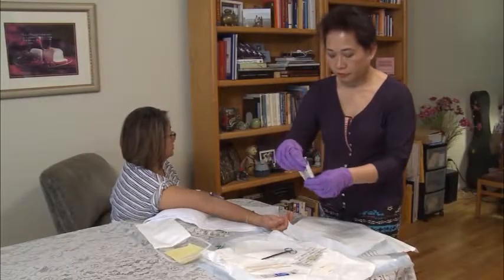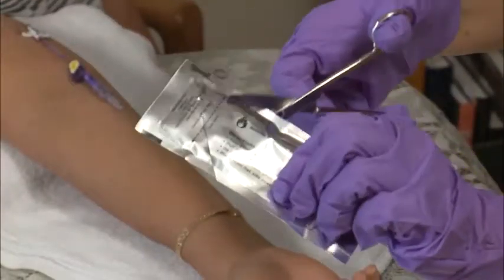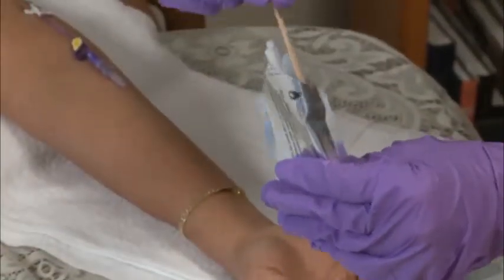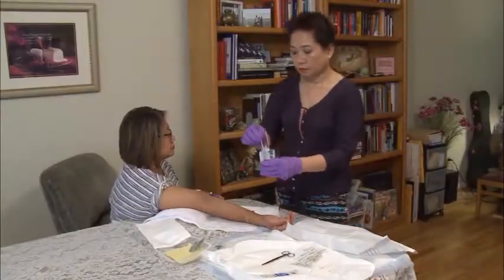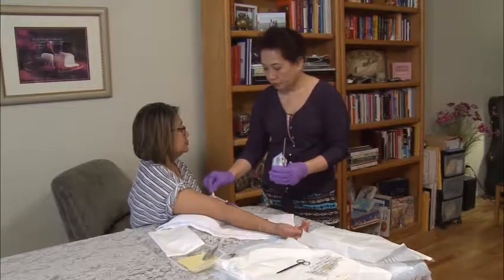Pick up the antiseptic solution package. Use the scissors to cut off the top end of the package. Insert the 2 Q-tips into the pack. Clean with the 3 large chlorhexidine swab sticks first. Pull up one swab stick and start scrubbing at the insertion site.